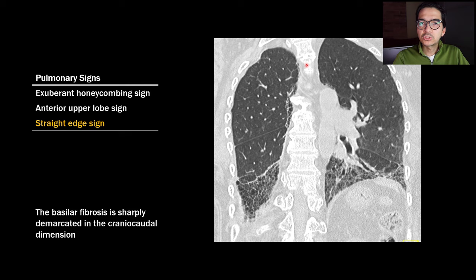The straight edge sign is seen on coronal images — you scroll posteriorly to where you see the spine, and the basilar fibrosis shows a sharp demarcation in the craniocaudal dimension. This is a positive straight edge sign. In a patient with IPF, by contrast, the edge of fibrosis is less well demarcated and tends to creep up the lateral edge of the lung rather than stop abruptly.